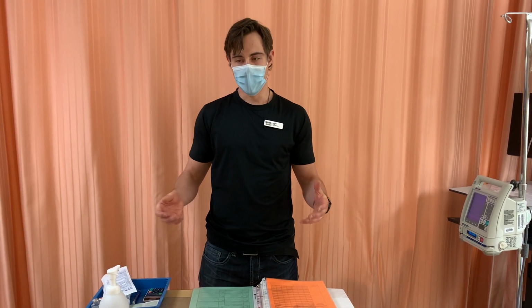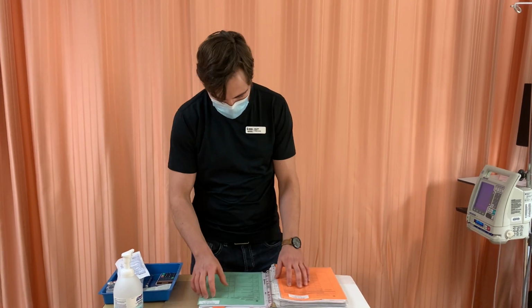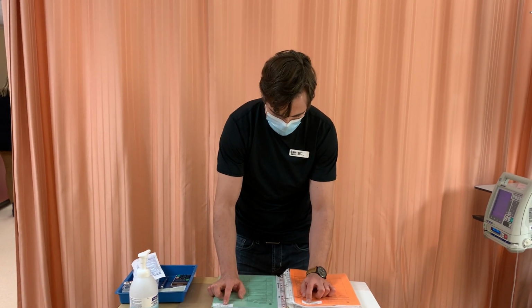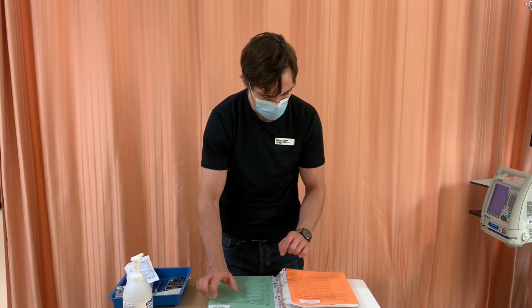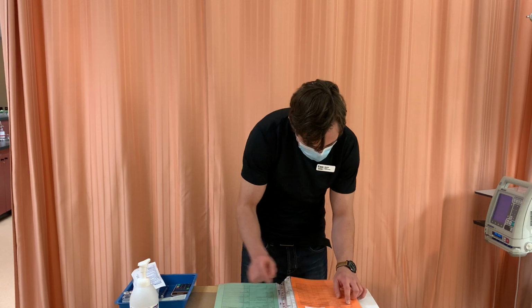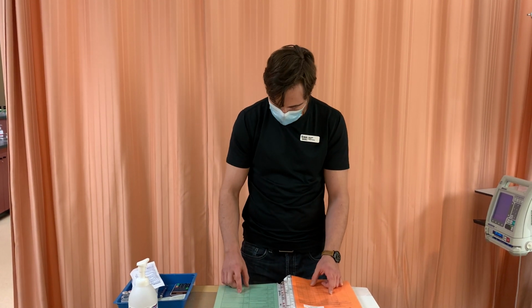I'm going to be demonstrating how to safely administer and prepare an IV medication via the piggyback route. To start, we're going to compare the physician's orders on a MAR. We have Vancomycin, and our patient has no known allergies. All orders are double signed and properly transcribed.